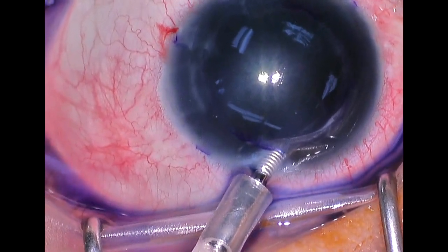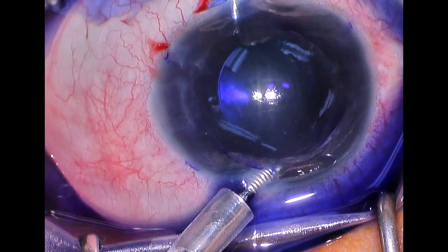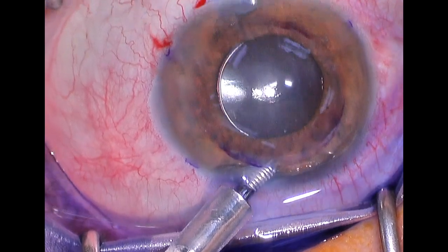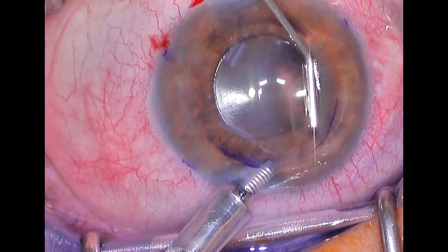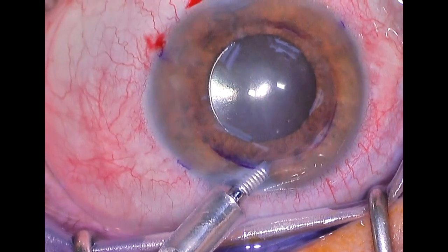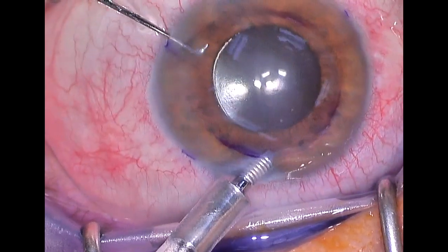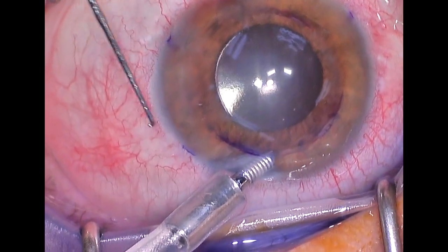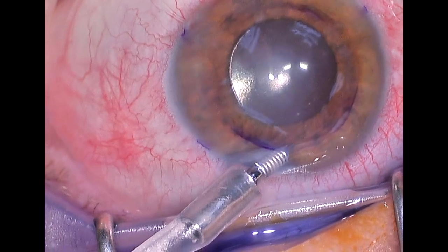There's the trypan blue dye — we are injecting that into the anterior chamber. Then we'll wash it out here momentarily and look for any flakes of remaining endothelial tissue that need to be removed. If you leave those little tags behind, they really do tend to reduce the adherence of the new tissue once it's implanted. There's just a little tag of tissue right there that we're going to remove, and we don't see any others at this point.